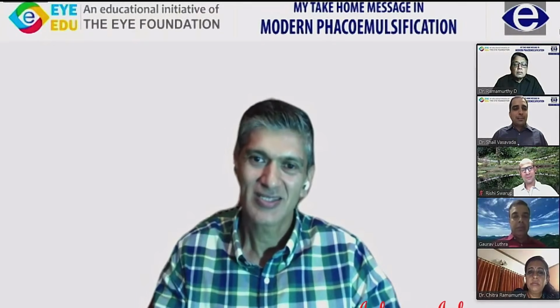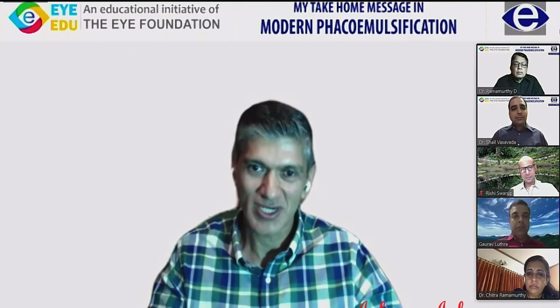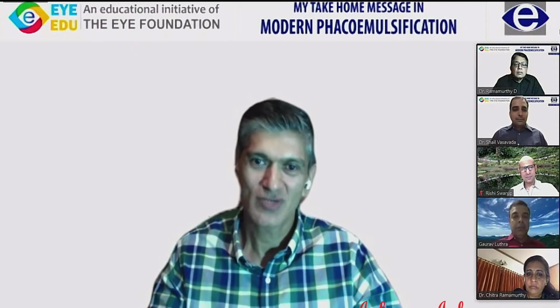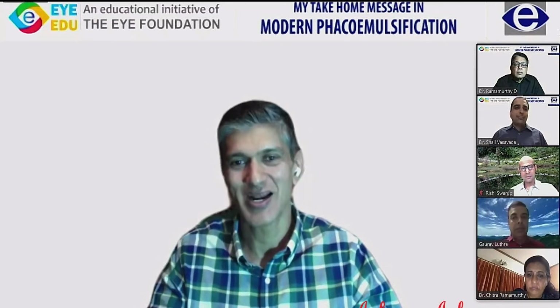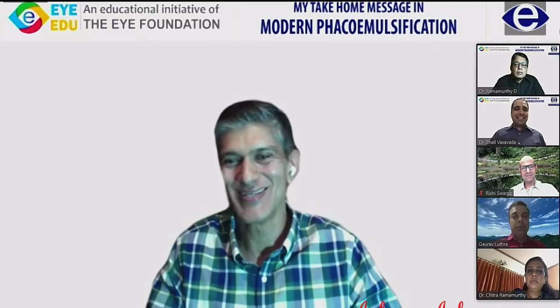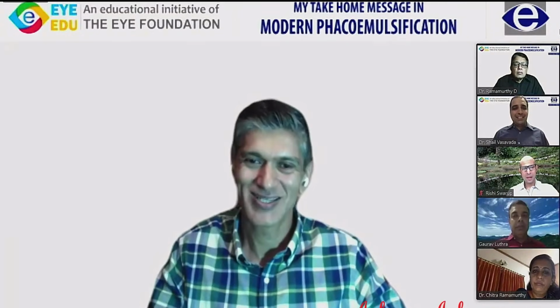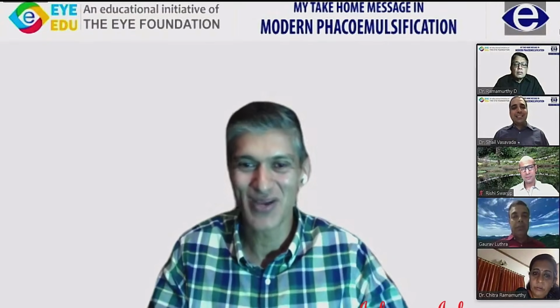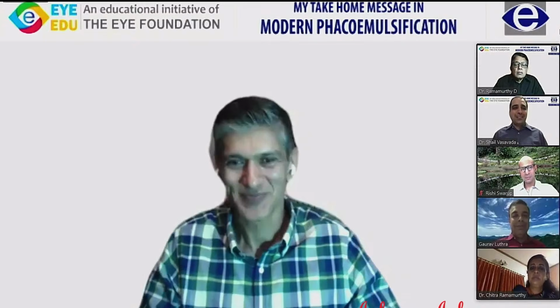And the other thing is that most of these machines, it is so convenient to use a 25 gauge vitrectomy because it's sutureless. But most of the anterior segment machines come with a 23 gauge vitrector, and I've been asking companies, why don't you change it to 25 gauge so that it's much easier. So if you borrow your trocar from your VR surgeon, then you should be careful, because many a time it is 25 gauge and then your cutter doesn't go in and you're stuck. Very true, sir. Very true.